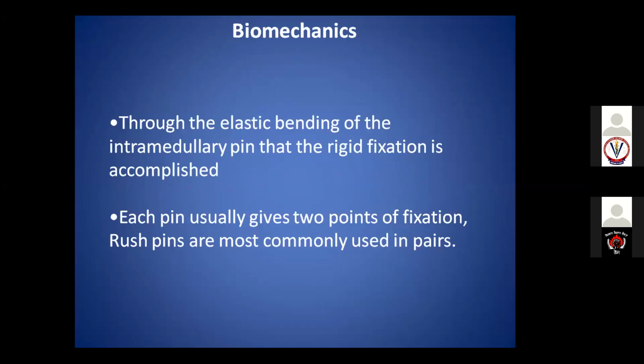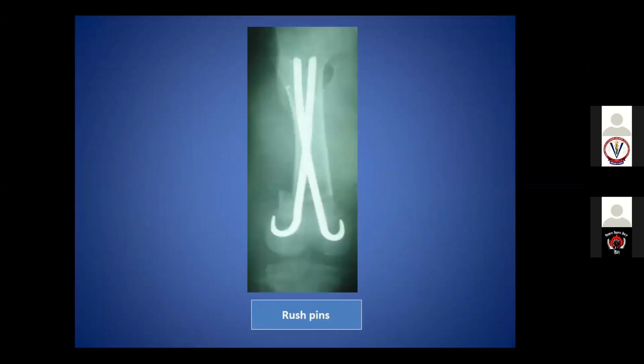So usually it does fixation at two different points, Rush pins. They are commonly used in pairs. They are never used singly. So they are used in pairs, because mostly we use two Rush pins at one time. So I will show you an X-ray.